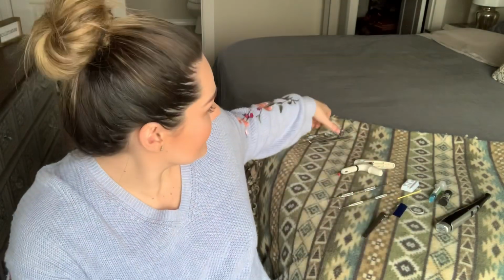So on the dentist side, he likes to have a mirror. This one's a little dirty, sorry, I've had it for a long time. An explorer, and this is actually called a pigtail explorer, but some of them are straight on the ends, but it's an explorer, and then a pair of cotton pliers. So that goes on the dentist side for a composite filling.